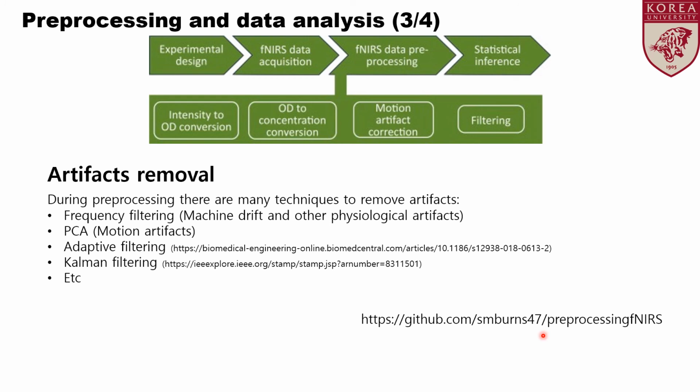If you want to learn data pre-processing or data analysis of NIRS data, you can download the MATLAB codes and learn and practice easily from these codes.